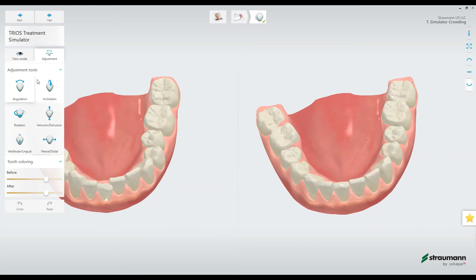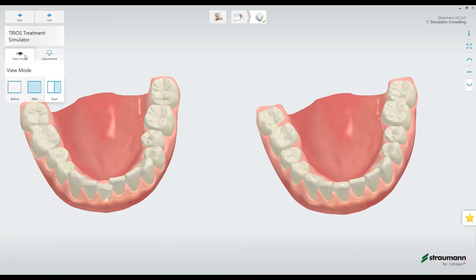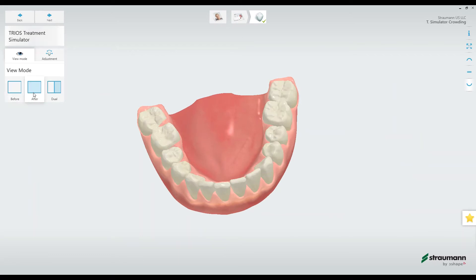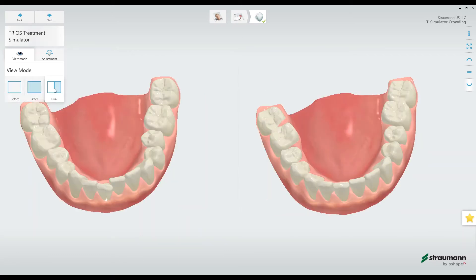Over here on the left-hand side, I see the view mode options: before only, after only, or both side-by-side as the dual option.